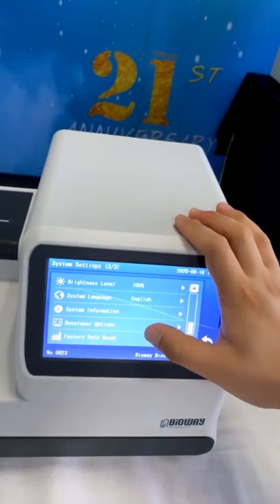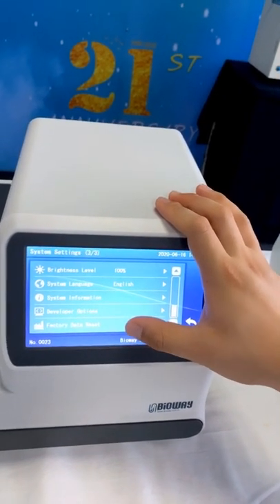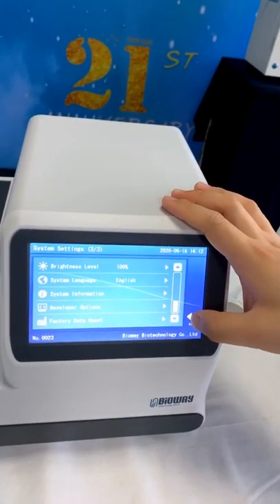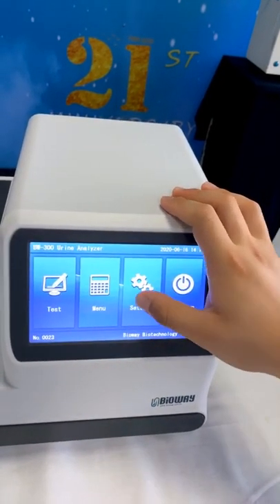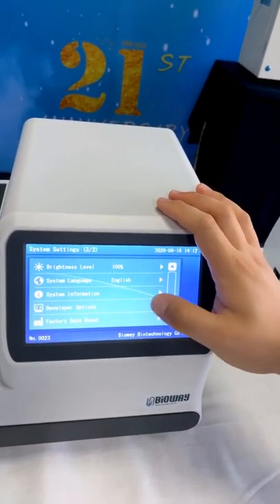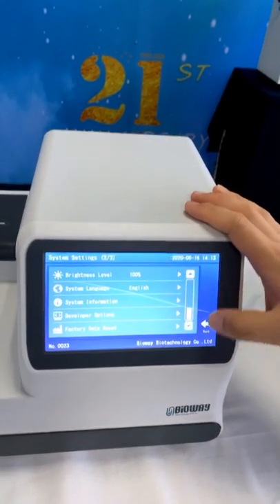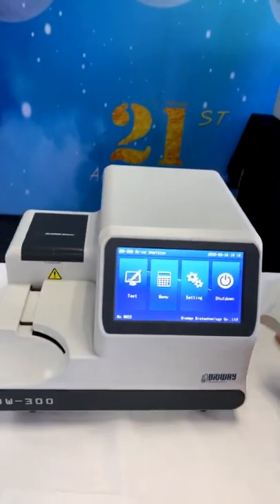For the last two items, develop options and factory data reset, I suggest you do not use them, just like the manual debug. Because the engineer will take the responsibility to instruct you to use them if some emergency happens. Okay, that is the system of BW 300. Thank you, Dina.